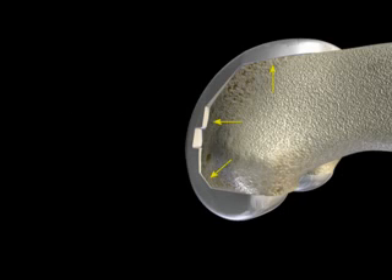The Zimmer Gender Solutions knee is designed to fit you, rather than your surgeon making you fit the implant. Using scientific data, the Zimmer Gender Solutions knee has been designed to help minimize overhang issues.